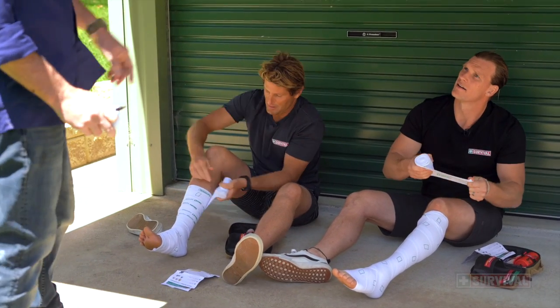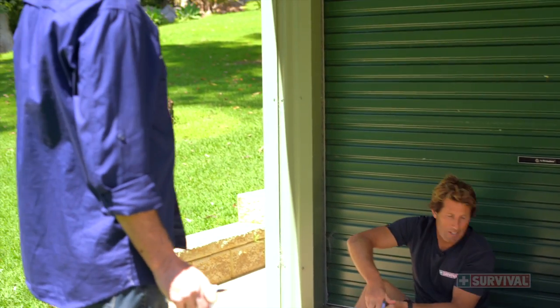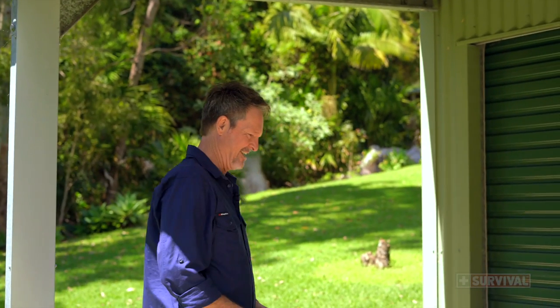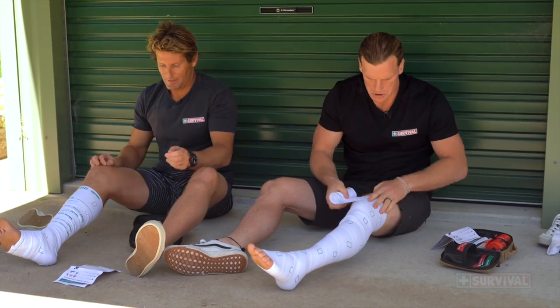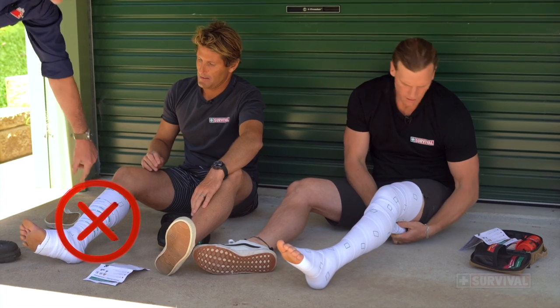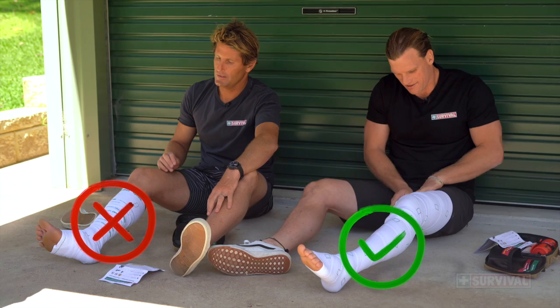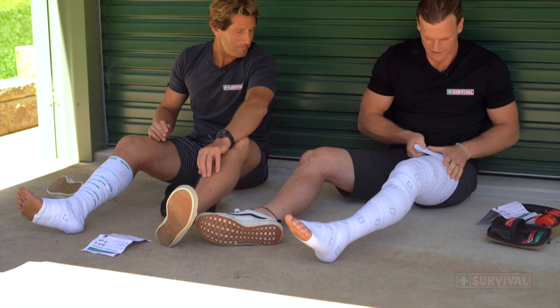All right Jamie, pick up where you left off mate. Keep going as far as you can go. I'm feeling the pressure. Feels good. Yeah, you ought to be feeling some pressure. Feel like the foot's pulsating. With that amount of overlap, you're going to be feeling plenty of pressure. Jamie, that's looking excellent mate. I can tell Jamie's watched this happen before — he's got a bit of a plan in his head about how he's going to do it.